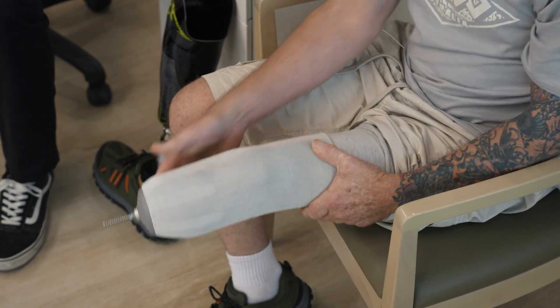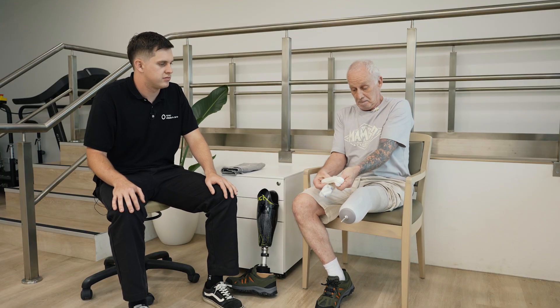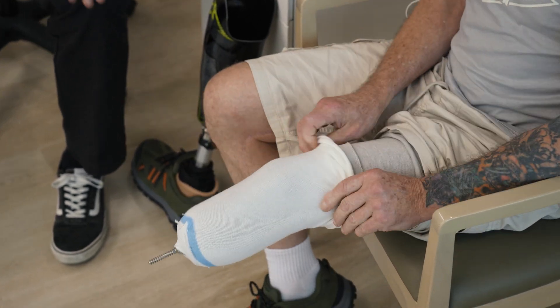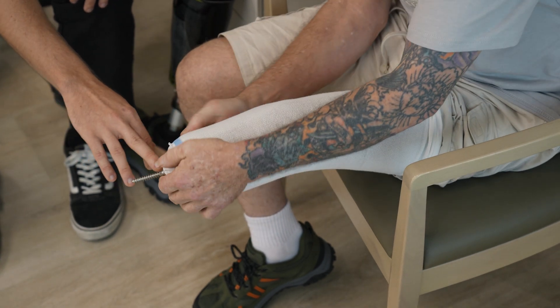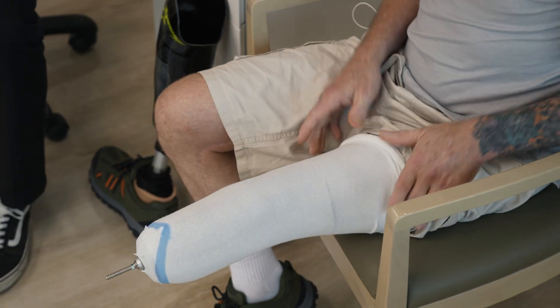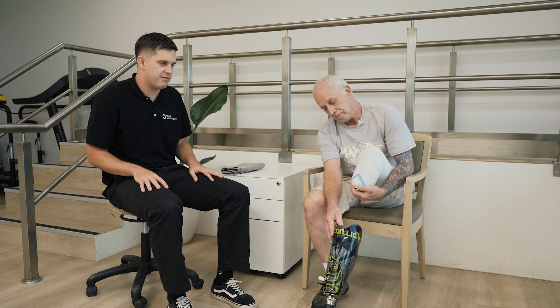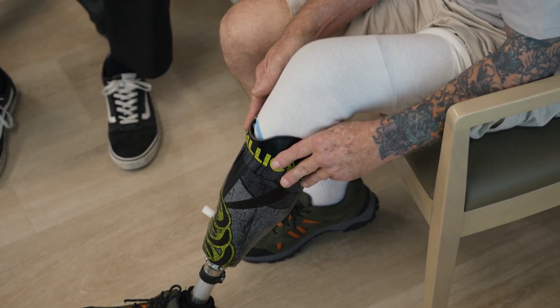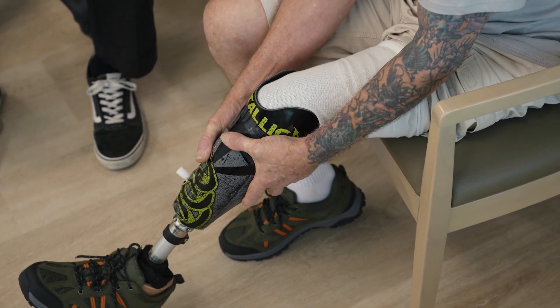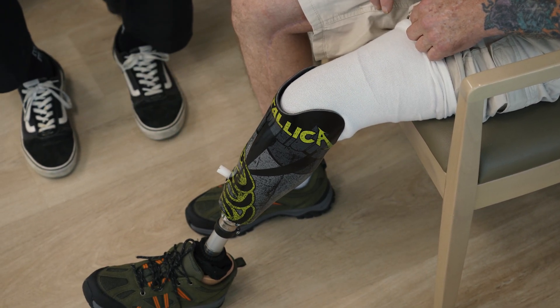It's important when fitting the liner that you keep it centralised and aligned properly. Then wear a packing sock. It's important when putting on this volume packing sock that none of the thread is caught, none of the sock is caught within this thread. Now you're ready to put the prosthesis on. You can do this at a 45 degree angle and push into the socket. You may hear it click, or you may see the dial on the side spin.